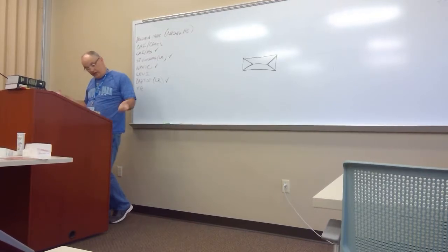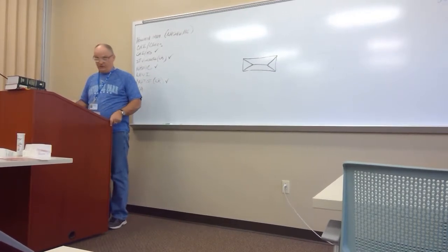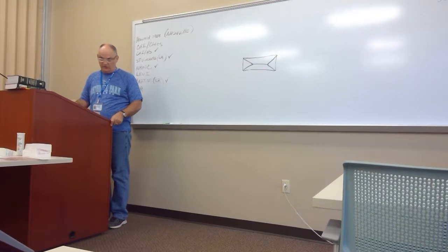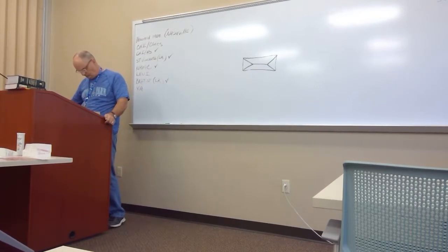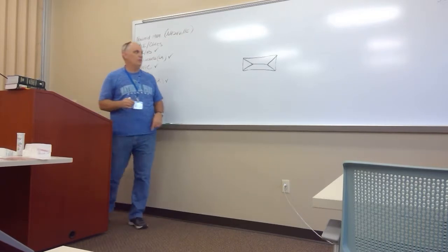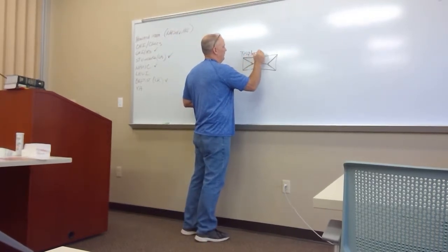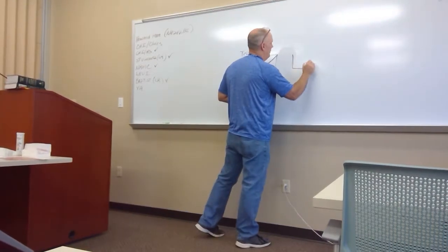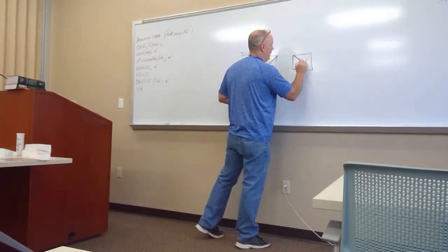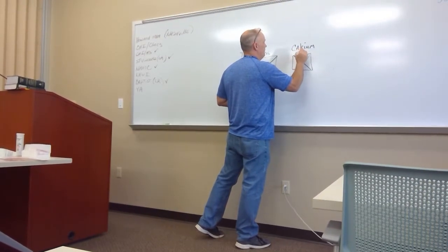Even though this kind of goes against what I'm telling you, there's a calcium oxalate crystal in that picture. There's also a triple phosphate crystal, and I see the little X, the calcium oxalate crystal, and the yeast. We're going to talk about ammonium biurate, since I'm drawing pictures. Okay, this is triple phos. Again, there are better pictures in your book. These are the most common that you will always see. This is calcium oxalate. I'm not going to draw the other form because this is the one you'll see most of the time.